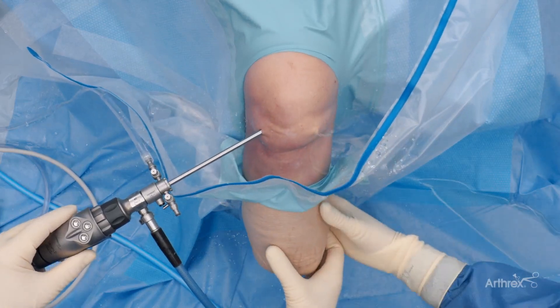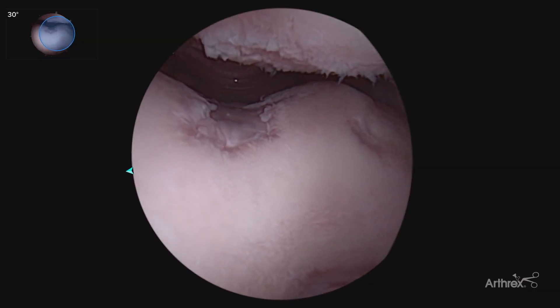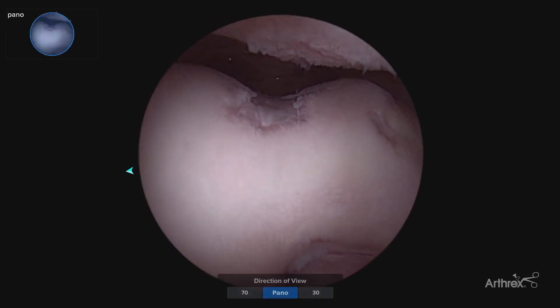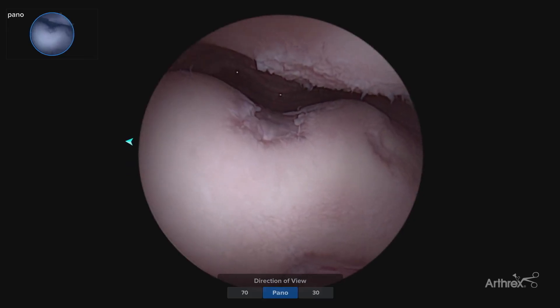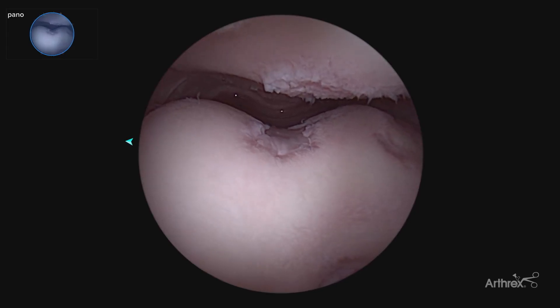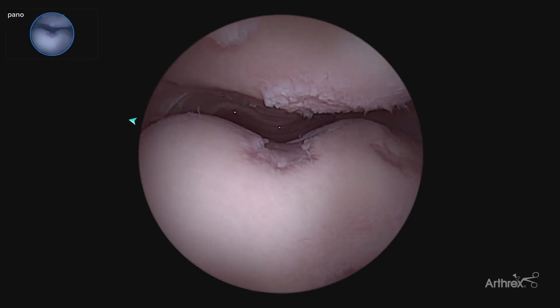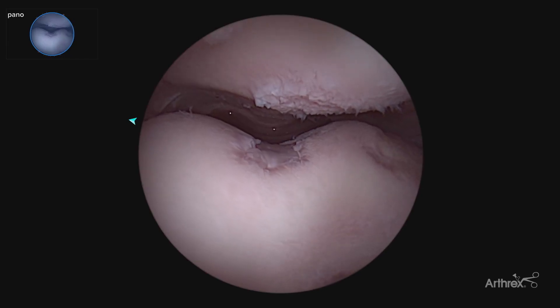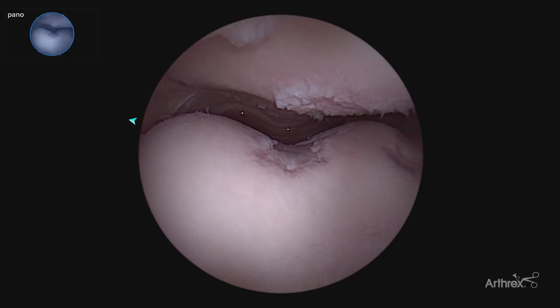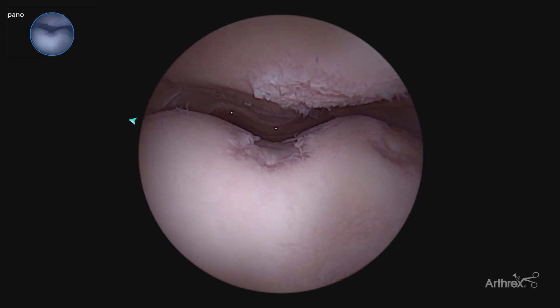We'll start with our standard diagnostic arthroscopy of the knee beginning in the patellofemoral joint, looking with our standard 30 degree view, being able to visualize both our patella and trochlea. The unique part of the Synergy Vision Panascope is switching to our panascope view, allowing for that broader visualization of the entire patellofemoral articulation, looking for articular cartilage lesions, and in cases of patella instability, being able to assess the depth of the trochlea, the medial facet, patellochondral injuries, as well as the lateral trochlea injuries, all in one view, giving you a much more comprehensive view of the level of pathology.